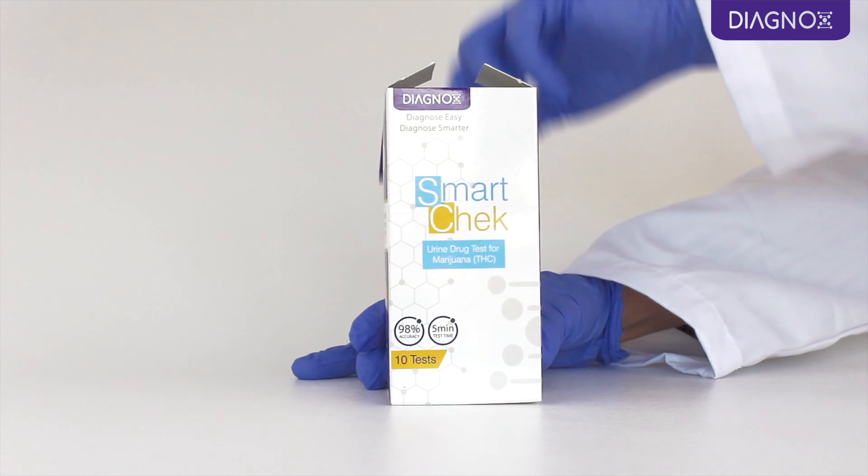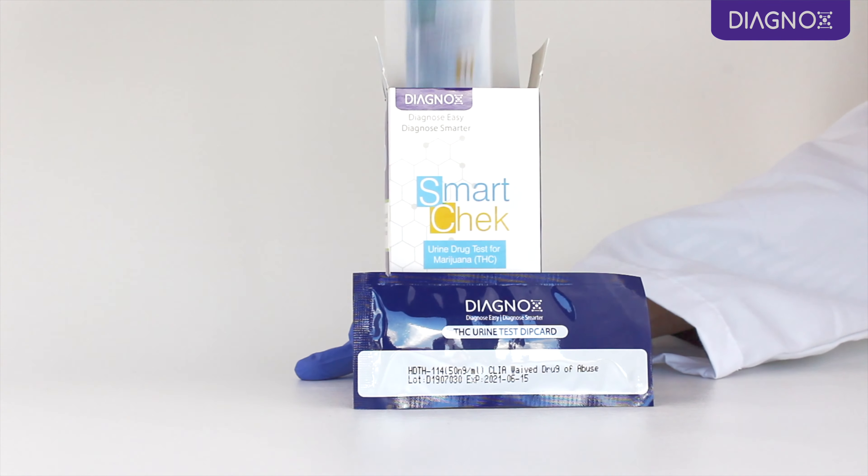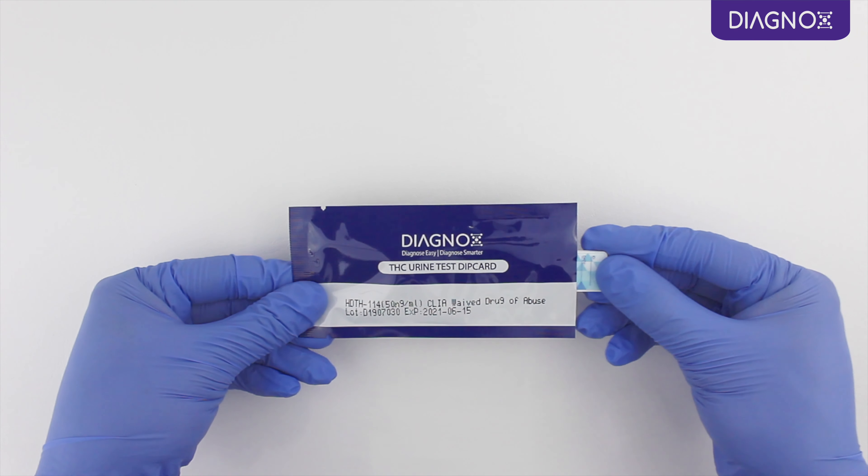Conducting the test is simple and easy. All you need is a SmartCheck THC Dip Card and a clean, disposable container. Just follow these simple steps.